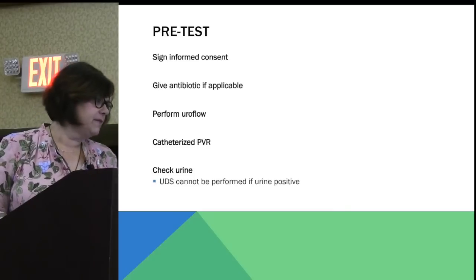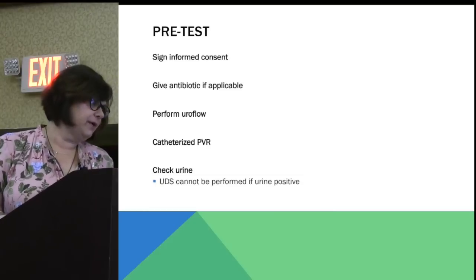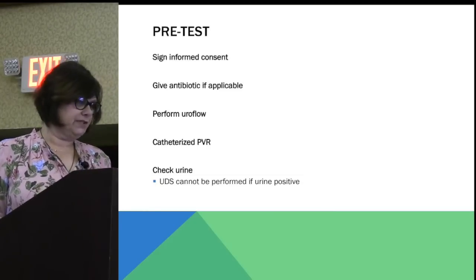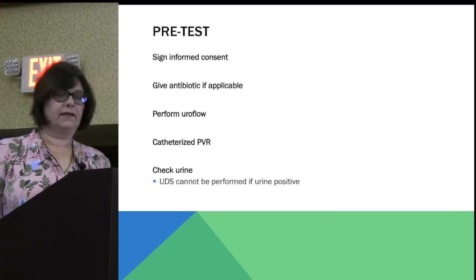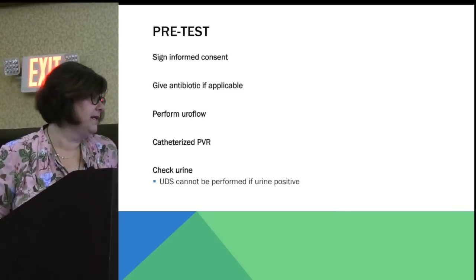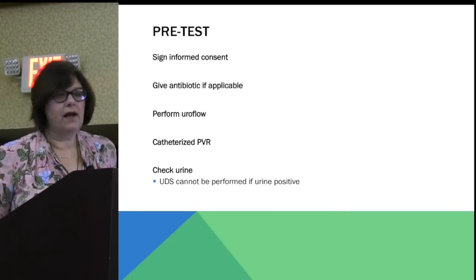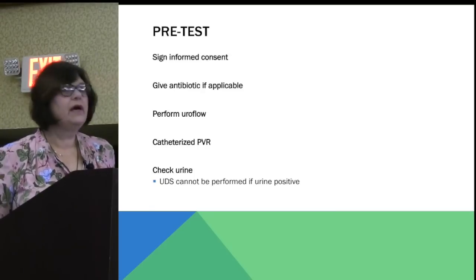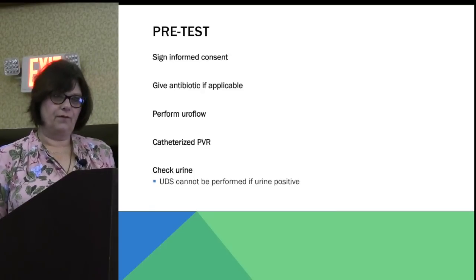So these are some of the things that are common during pre-testing, all right? Some places want the patient to sign an informed consent, considering it a procedure. I don't see that often, but it is possible. Give them an antibiotic if that's what your practice decides they want to do. And then after all that, we perform the uroflow.